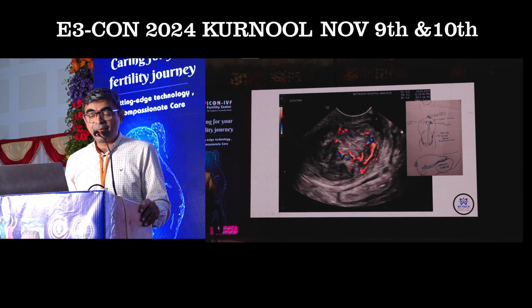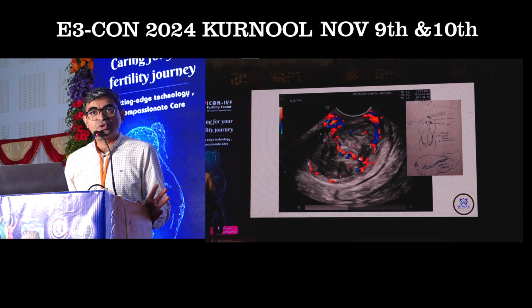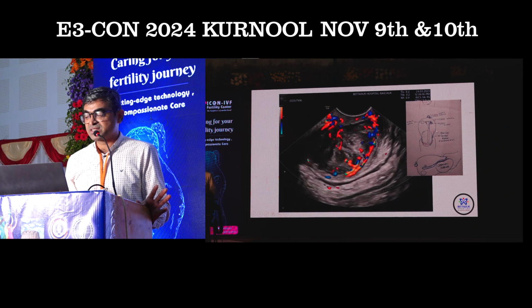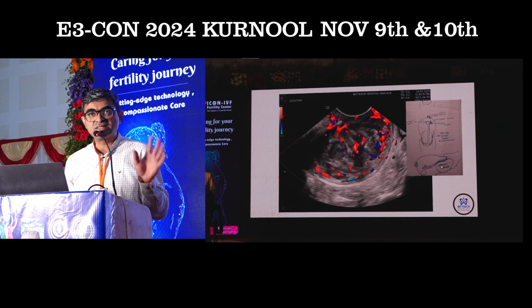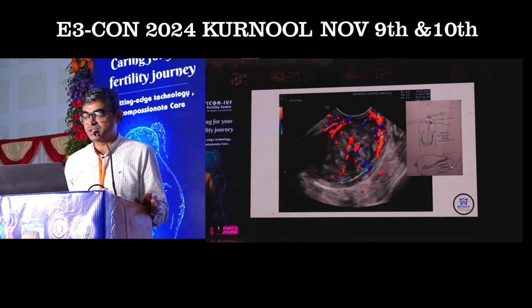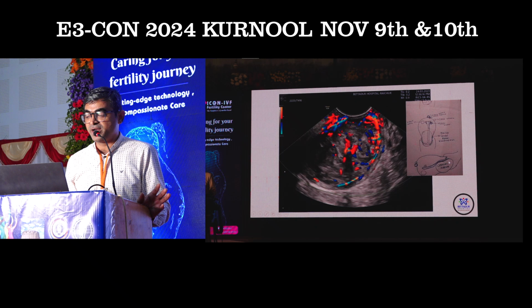So now when I have mapped this uterus saying that there is a large cervical fibroid, it will tell the surgeon how he should approach this. When he knows that this cervical fibroid is actually protruding into the vagina, he may not go trans-abdominal or even laparoscopic approach. It is just a vaginal approach where you can give a nick over here and you can reduce this by debulking surgeries. So that is enough. That's some types of mapping.